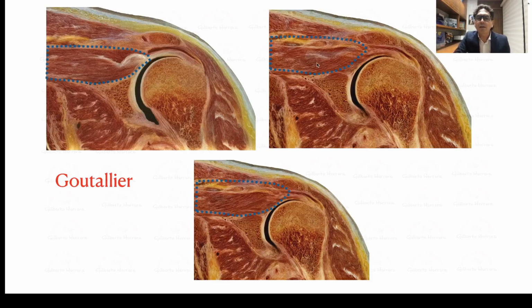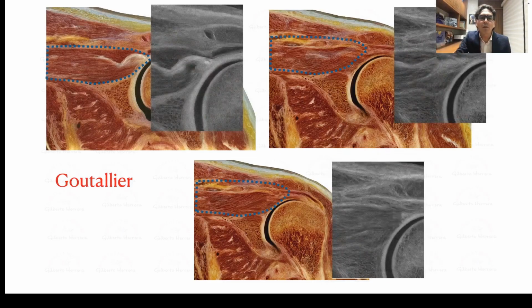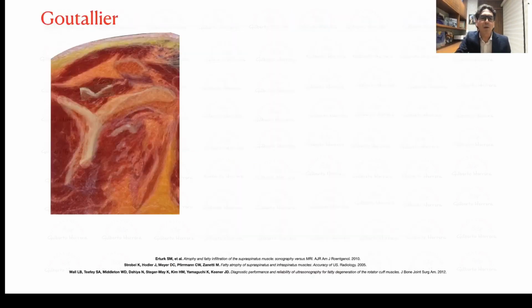And obviously, the characteristics of this muscle, since it has fatty infiltration, will be different from the muscle pattern we're comparing it to. Let's take a look. So on a grayscale, what we're going to look for is this pattern of the central tendon, which starts to disappear at stage 1 and is completely gone at stage 2. Here, there's no tendon anymore. So now let's do a practical exercise to see how this would look in our image, in our short axis view.